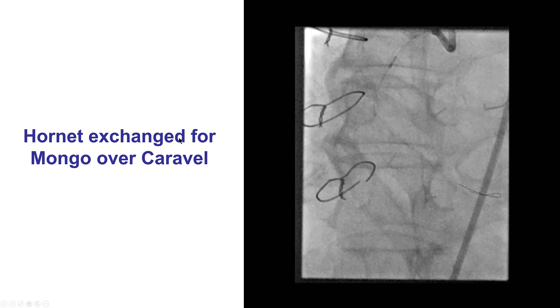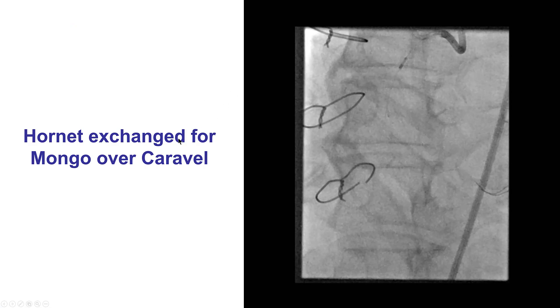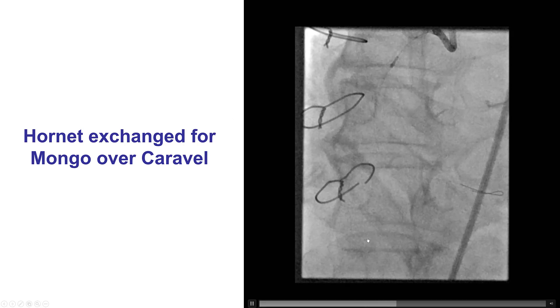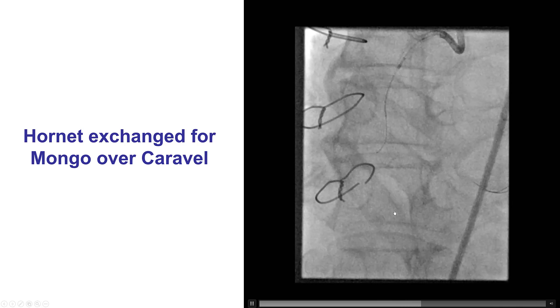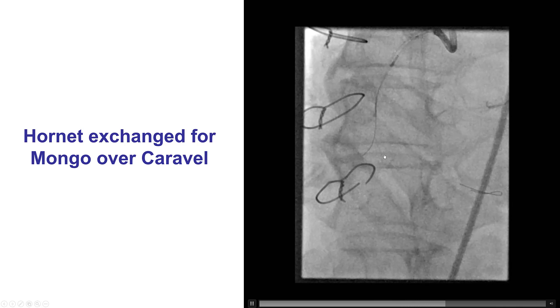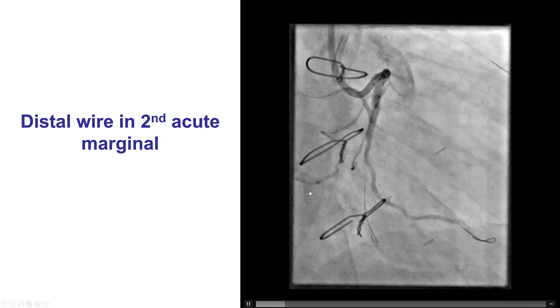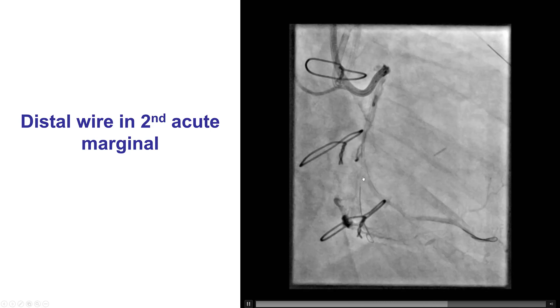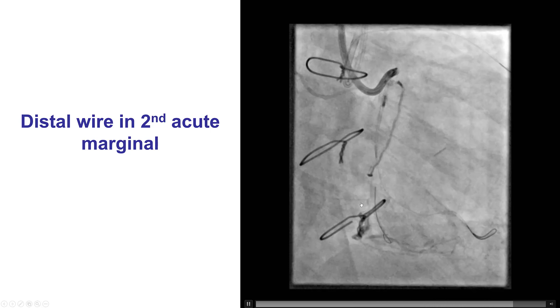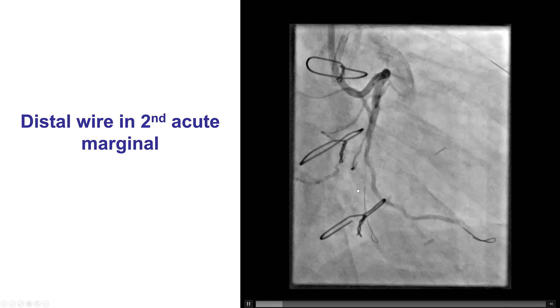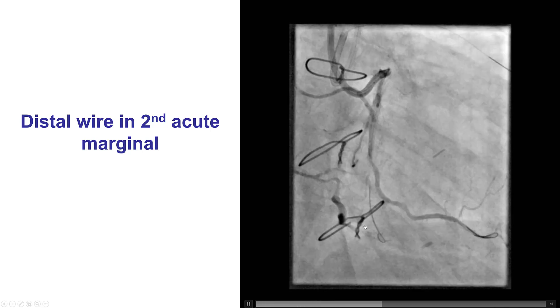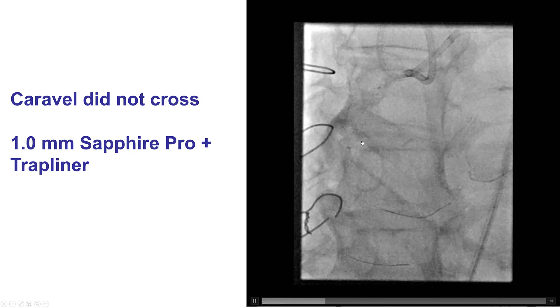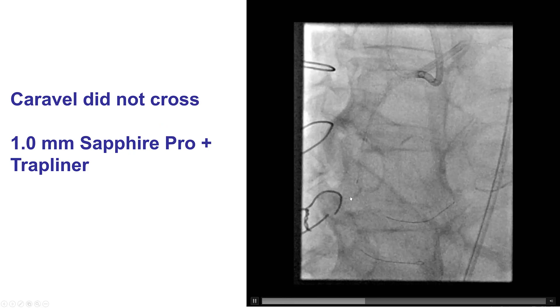The Hornet was then exchanged for a Mongo guide wire over a Caraval microcatheter, and that seemed to advance along the anticipated course of the right coronary artery. However, the wire then stopped going in the same course and seemed to be going on the lateral wall — it turns out that the wire went into a second acute marginal branch.